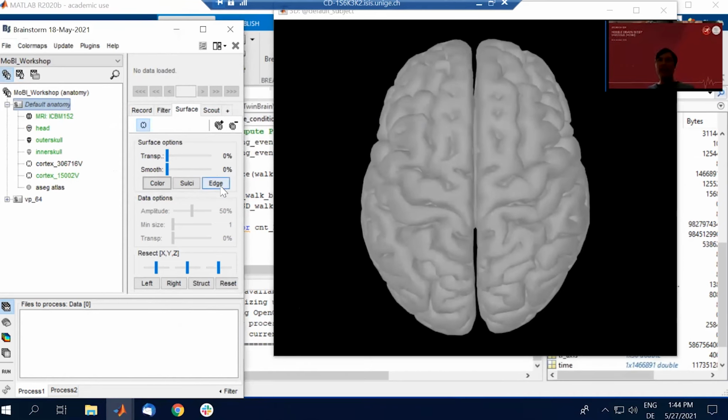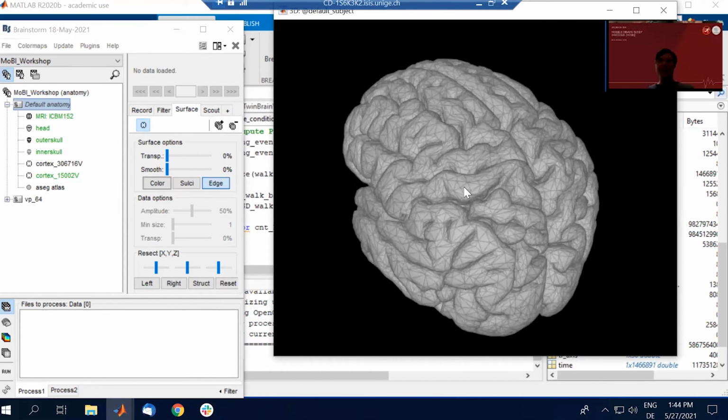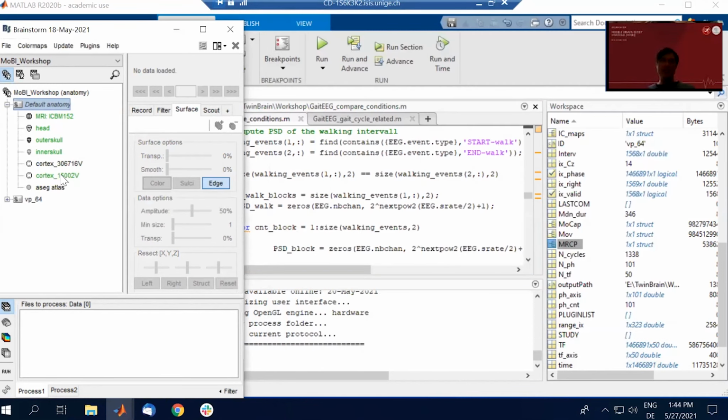This is then just the rendering of this cortex, because in the computer, everything is digital. And that's already a rendering of the cortical surface. And at every intersection here, there is one node, meaning at every intersection, there is one source. Those are 15,000, because we have 3D, it's 15,000 times 3 blocks. Also, it says cortex 15,000.